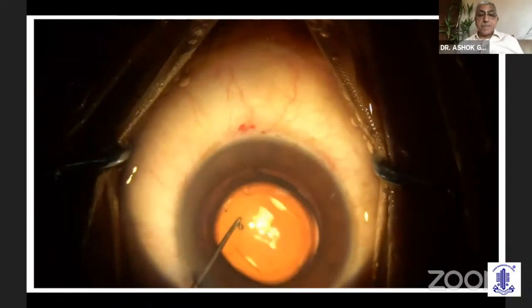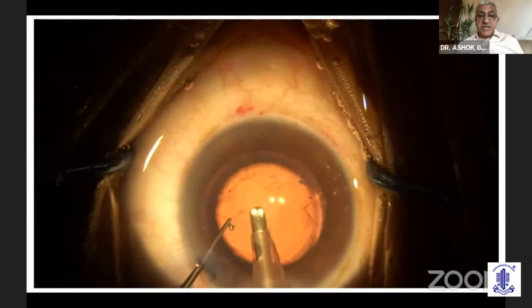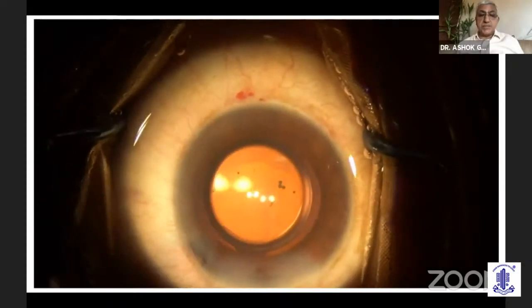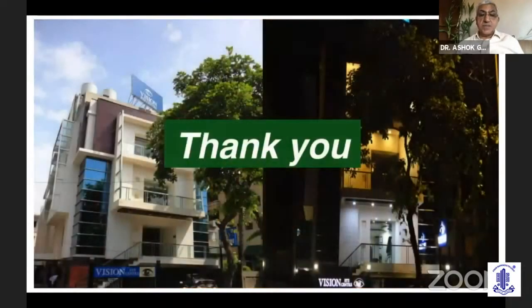And well, I've succeeded. This has worked, but you need to be cautious and take all the precautions that we spoke about in order to weigh your decision. Your experience with these surgeries should matter. How you've done in the past should matter in taking a decision whether to convert or whether to go ahead and do a phaco in a hard cataract with a broken rhexis. Thank you very much.